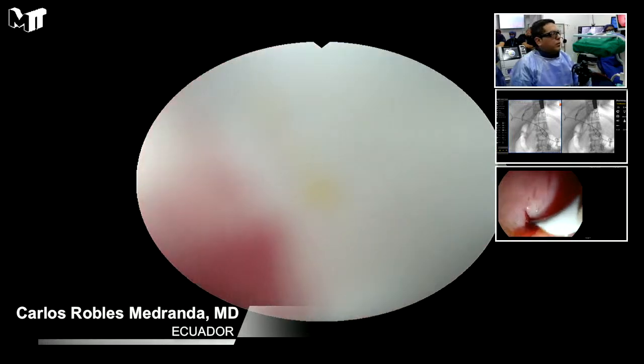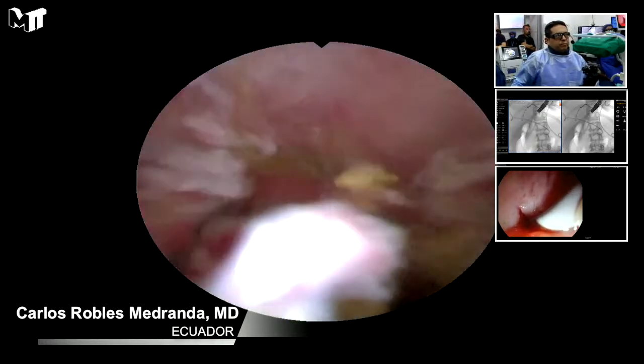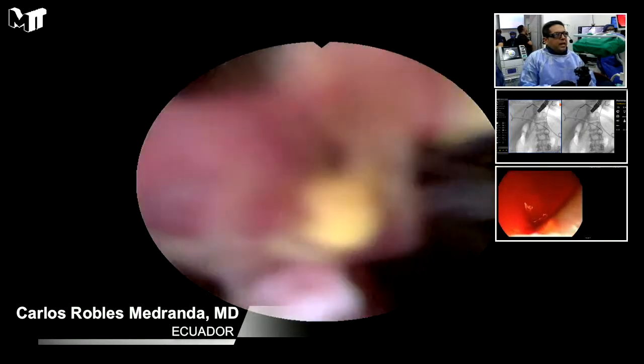So I want to see where I am. And I need to see what is the damage that this patient has, you know?